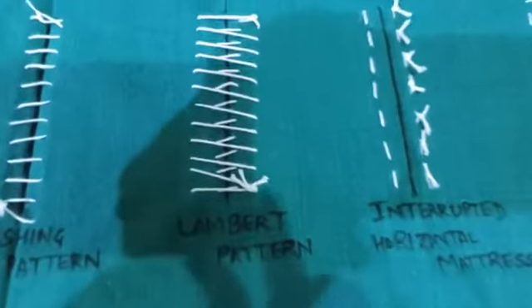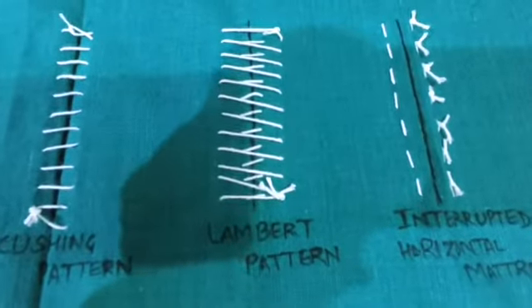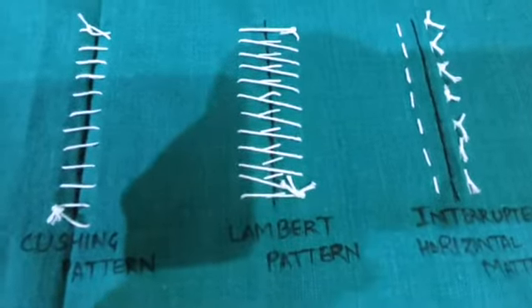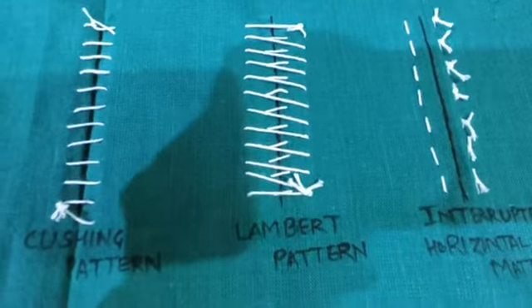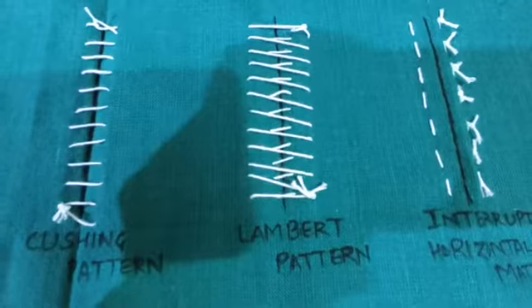The fifth one is the lambert pattern. It is also used in the inversion suture, and it is also used for the apposition of the wound of the hollow visceral organs.